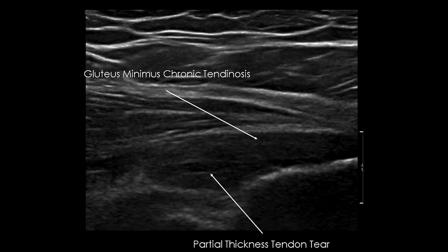Example of tendinopathy of the gluteus minimus with partial tear. The tendon has a thickened, hypoechoic, and moderately dedifferentiated appearance reflecting chronic tendinosis, associated with an anechoic pseudoliquid linear lesion in the longitudinal axis of the tendon corresponding to a partial tear.